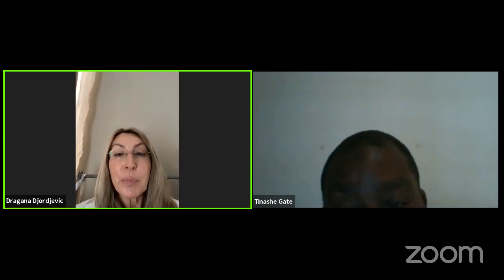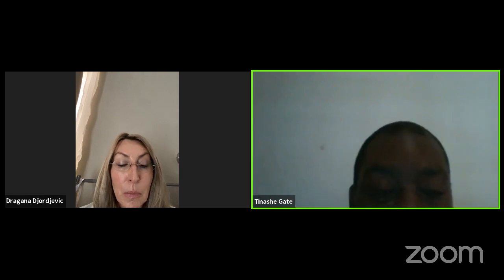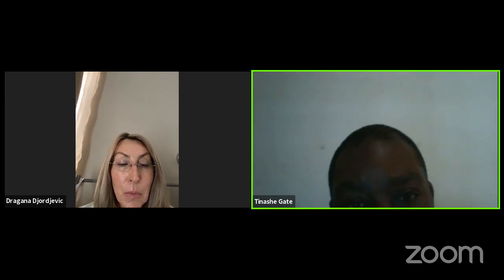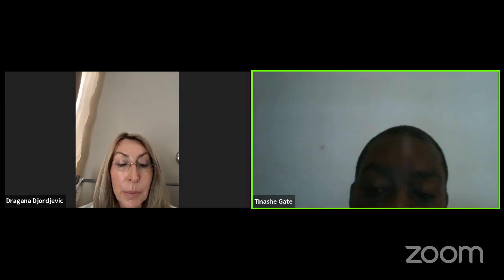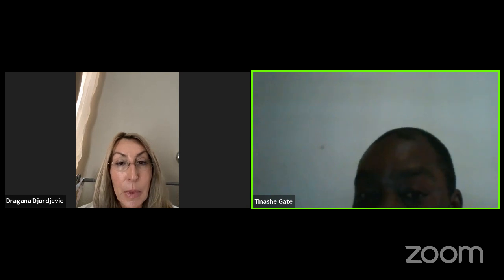Yes, thank you. But then the question is, why are you then putting a 1 chip camera when you actually want more clarity? Well, the 1 chip camera is for cost effectiveness. We can actually put a 3 chip camera, but naturally a 3 chip is more expensive than a 1 chip camera.